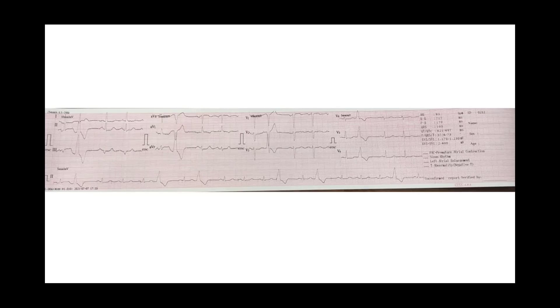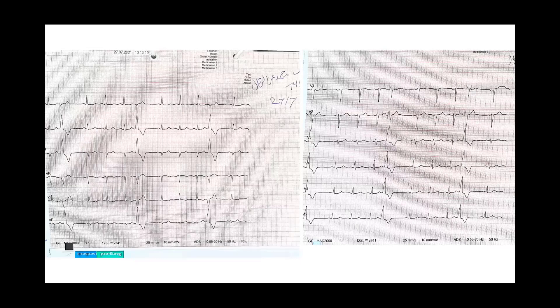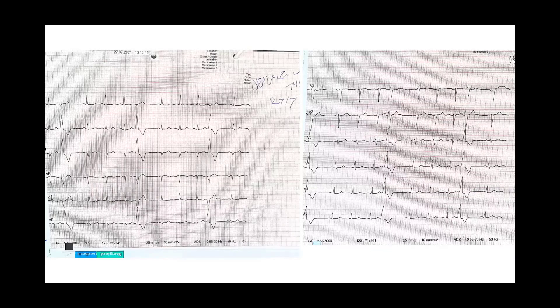Another 12-lead ECG for the patient with ventricular quadrigeminy. Here, clearly an inferior axis with a Lead I biphasic QRS complex and early transition at V3. As Dr. John explained, this suggests approximately 50% RVOT and 50% LVOT according to localization criteria.